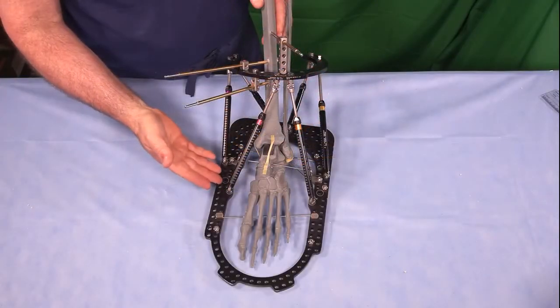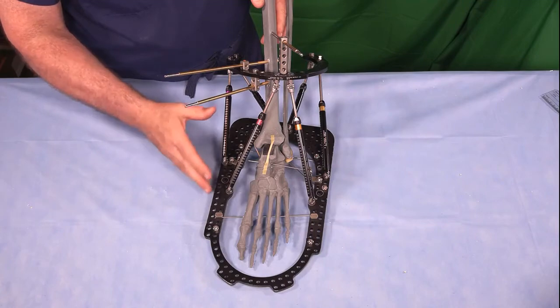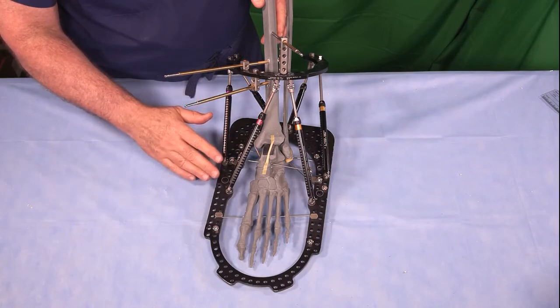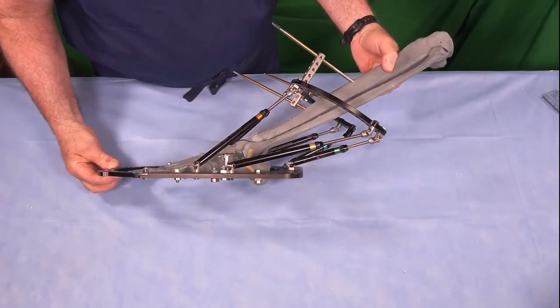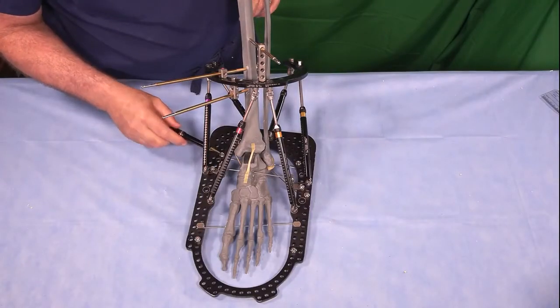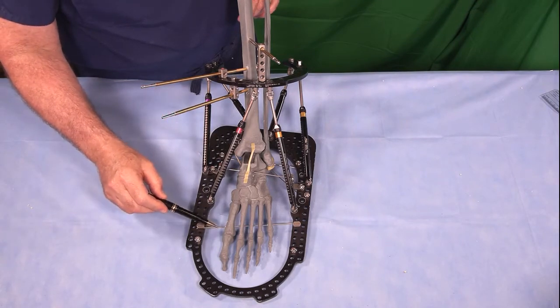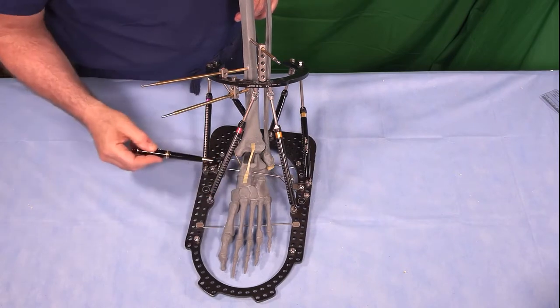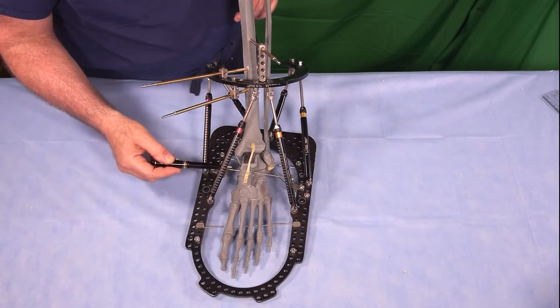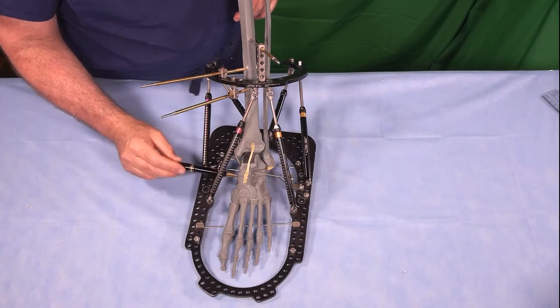So now we've completed the fixation. In situ fixation. We're not trying to correct the deformity acutely, just to match it. There's about a 60-degree equinus. Fixation started off with the foot fixation first. 2 wires in the heel, 1 wire in the metatarsal. Later at the end, after I put my struts in, I added a talar neck wire to focus the forces of correction on the ankle joint and not on the midfoot joints.